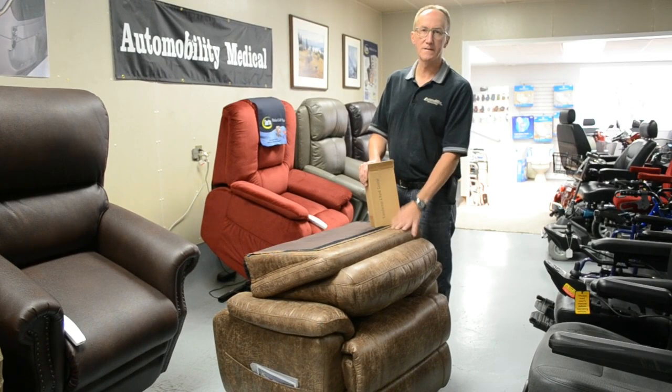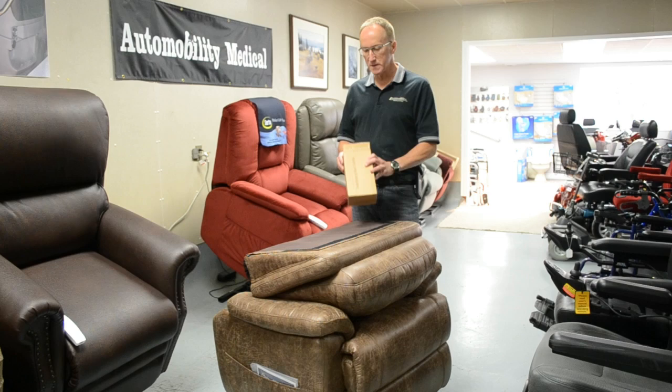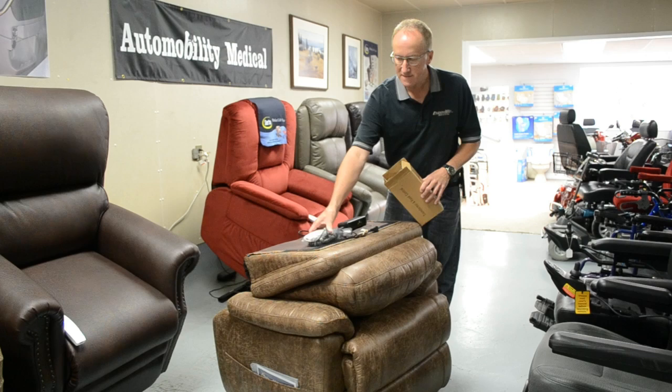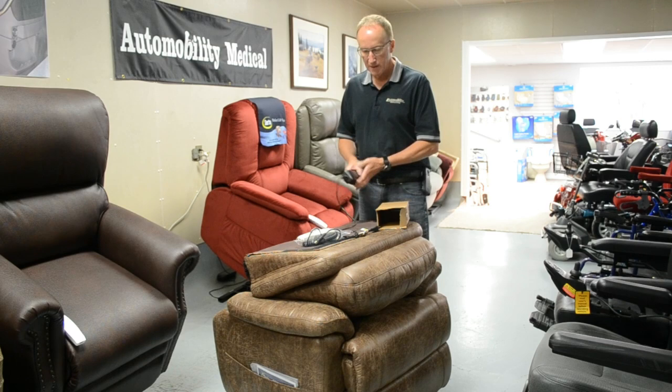Today we're going to show you how to put a chair back onto the chair after you've received it. It will come in a big square box — all you got to do is slide it out. You're going to have two pieces: the main base and the top. Also in the box will be the controller, which they also call a pendant, which is basically just the buttons that everyone uses to run it up and down. And then you have a transformer which has backup batteries inside.